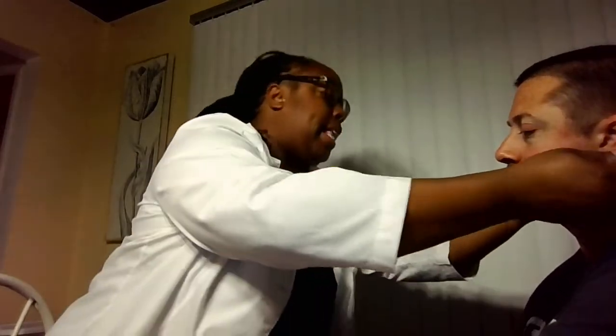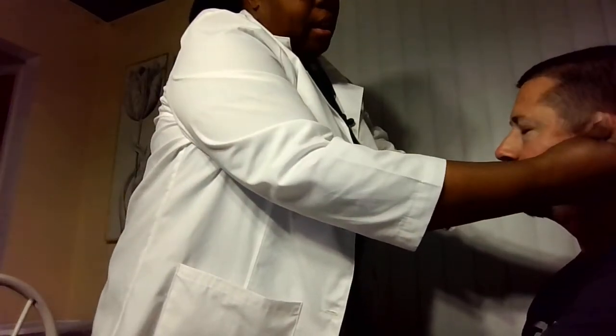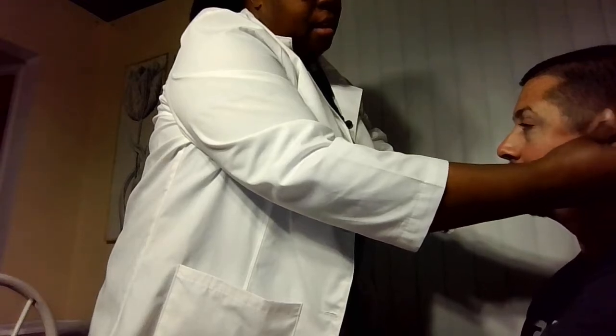All right, we're almost done. So I'm checking your ears out now. I'm looking, seeing they're symmetrical. I'm checking the outside, making sure there's no redness, no drainage. I'm pulling here. Is there any pain? Nope. No pain. Okay. And also with my scope, I am going to take your ear. I'm going to pull your earlobe up and back.